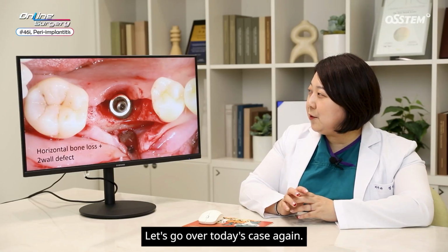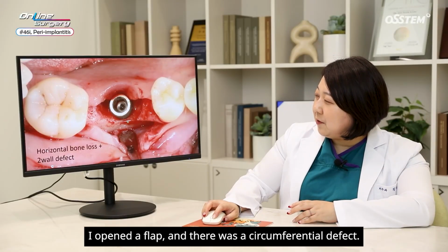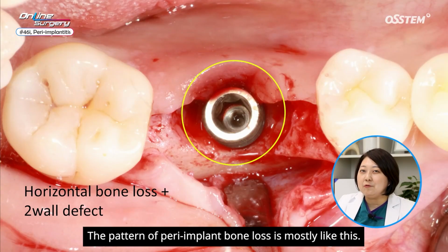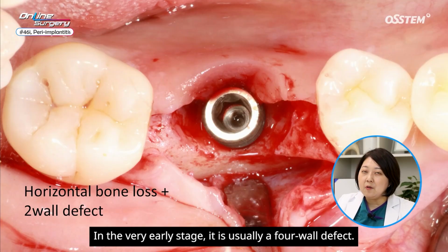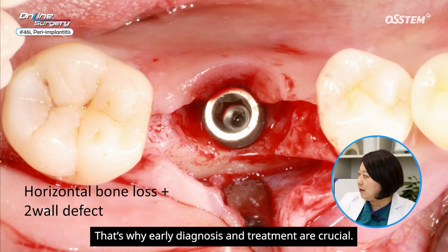Let's go over today's case again. I opened a flap, and there was a circumferential defect. The pattern of peri-implant bone loss is mostly like this. In the very early stage, it is usually a 4-wall defect. As it progresses, the top region shows horizontal bone loss, while the bottom becomes a 2-wall defect. That's why early diagnosis and treatment are crucial.